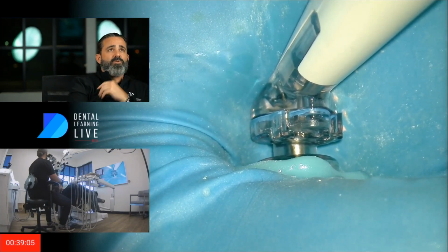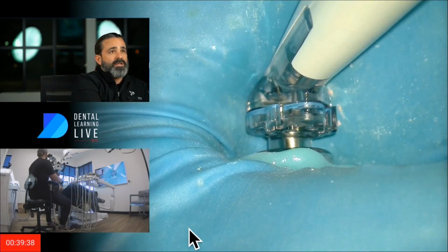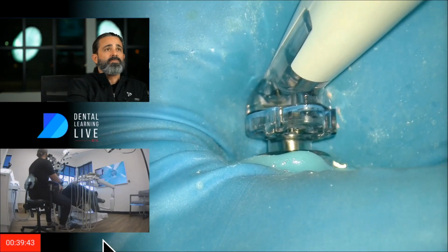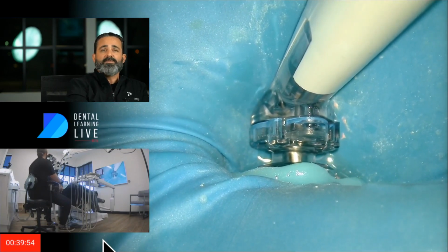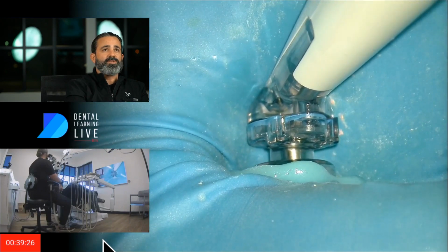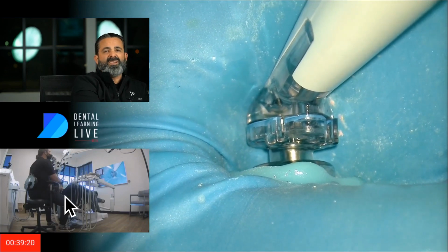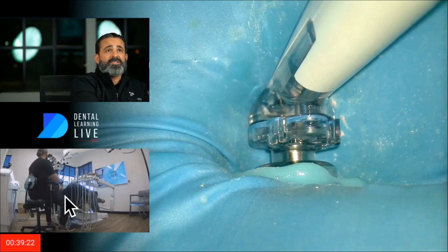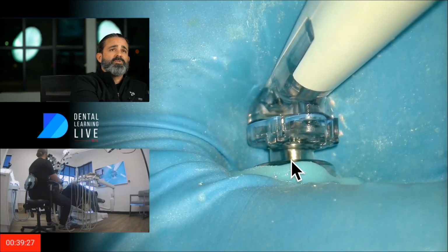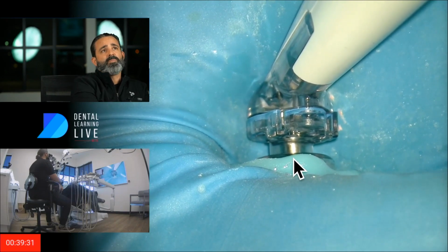I'm going to fast forward until I find that episode. And I want you to actually look down here at me when I'm going through this. Don't look at my ponytail, but just look at, I'm talking to my assistant right now, right? Things are smooth sailing. And let me go back. Watch what happens. So if I go back here, watch my head, I'm talking to her. And subtly, squirrel, right? I just kind of look away. And what happens is, as I'm doing this, pay attention now as I move, see what happens here to my procedural instrument.